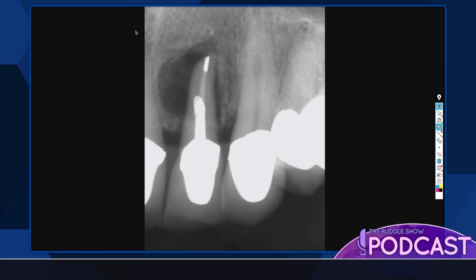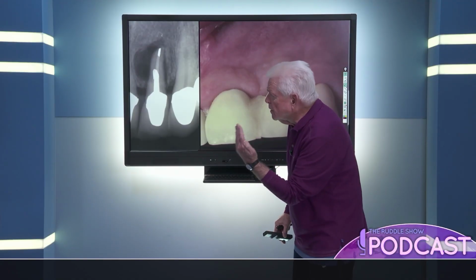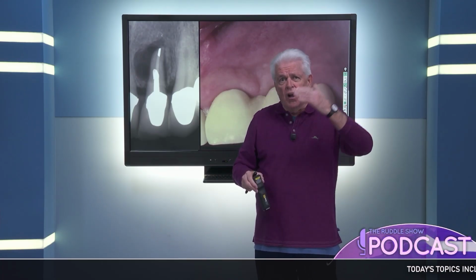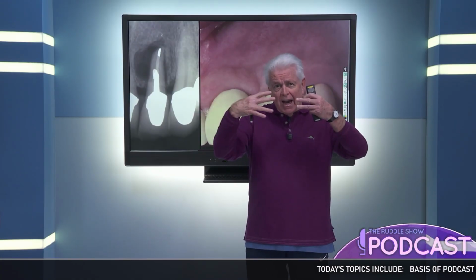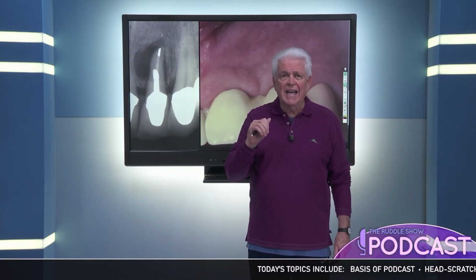So you're saying, great. So this is at about, we didn't get any photos right then, but I just want you to see the splint. This is my splint, and Hideki asked me now exactly, we want a soft splint. We want a splint that allows movement. We want the tooth to be able to move a little bit so the Sharpey's fibers can find each other, the Sharpey's fibers on the osseous side and the Sharpey's fibers attached to the root. And fascinating studies in the textbook right over there, Andreasen, they actually find each other, and that eliminates a lot of times resorptions and ankylosis.